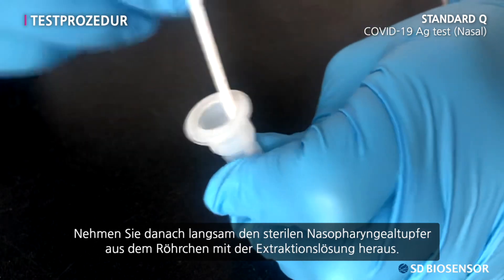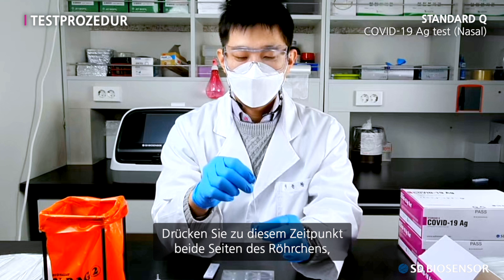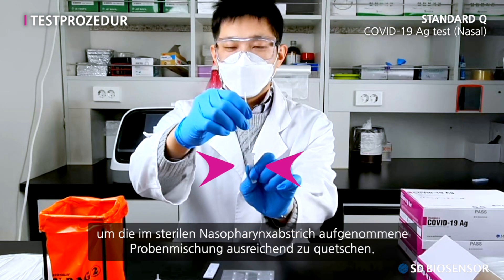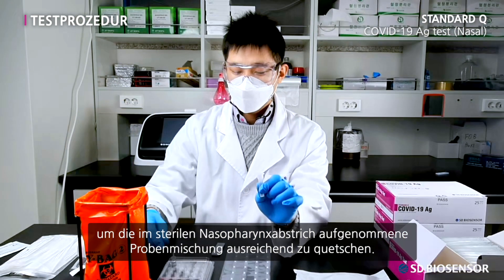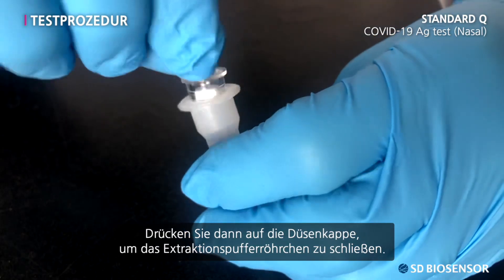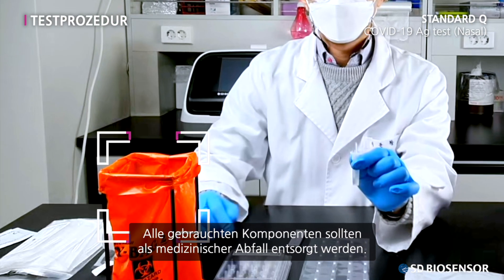After that, slowly take out the sterile swab from the extraction buffer tube. At this time, press both sides of the tube to sufficiently squeeze the specimen mixture absorbed in the sterile swab. Then press the nozzle cap to close the extraction buffer tube. All used components should be thrown away as medical trash.